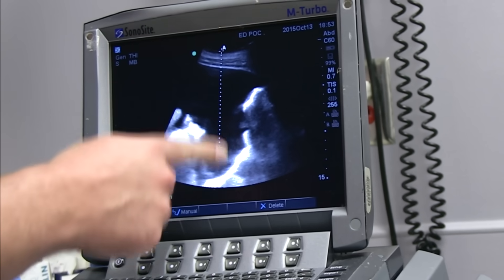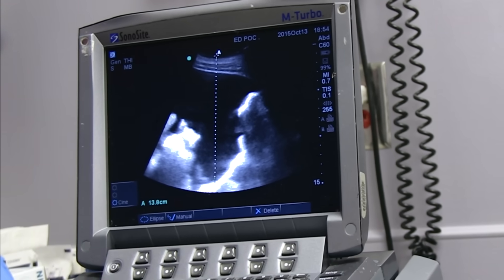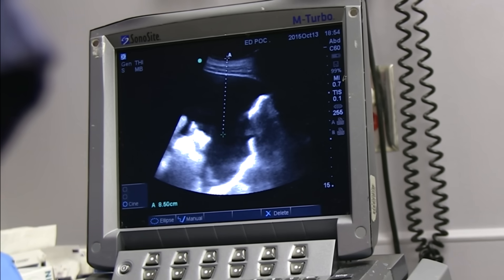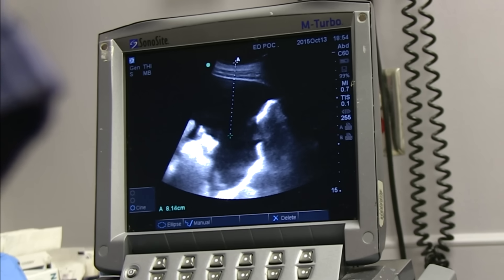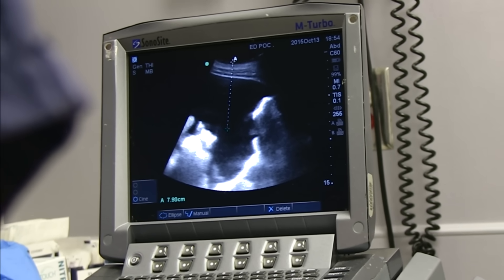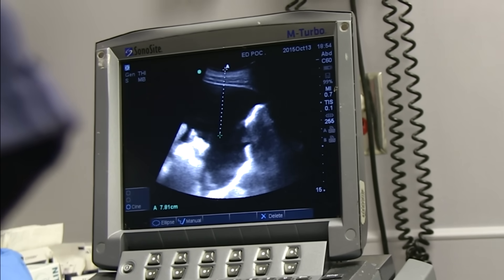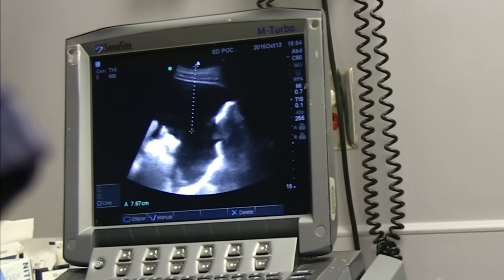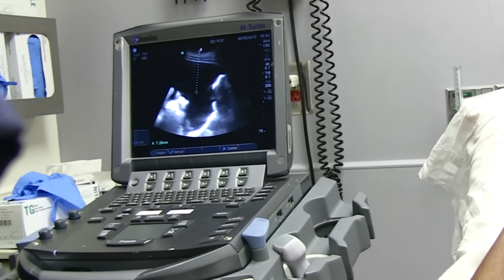If you were to stay on this plane it'd be 14 centimeters, but the needle's only 7.25 centimeters. So you could bury the needle without hitting anything. The patient is watching — we're not going to hit anything, we're not burying any needles. You want to make sure the skin is anesthetized before you start. You can see 7.25 centimeters — seven and a quarter — as long as you're going straight in.